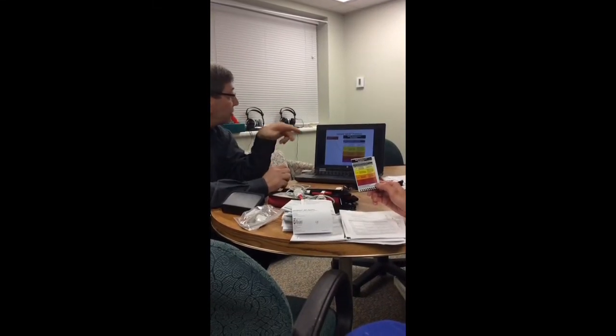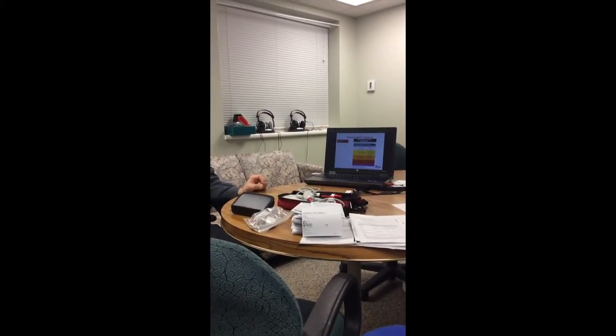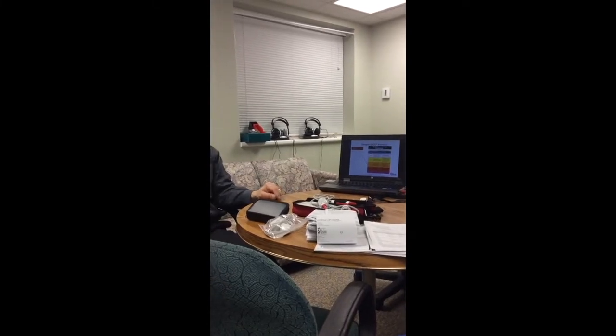But let's talk about accuracy, because I know that that's an important thing for you guys. When we did the specifications, we did the specifications based on some chemistry analyzers. I will tell you, if you had an iStat, you know what an iStat is, 2 of them next to one another, and you calibrated both of them, you get 2 different readings. They're close, but they may be off 1 gram per deciliter, or they may be off so many percentage on the hematocrit. It's not a perfect science.